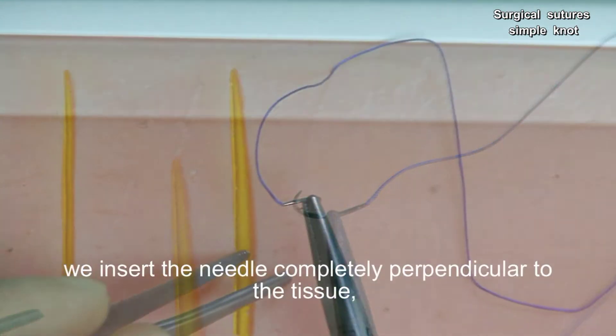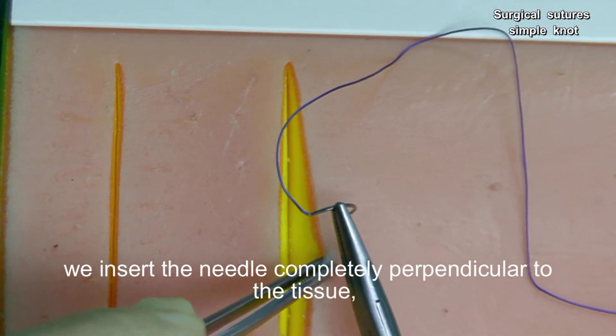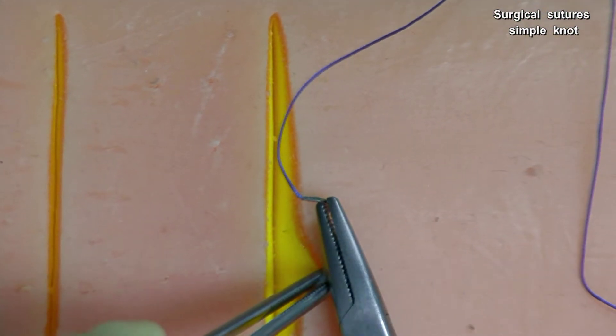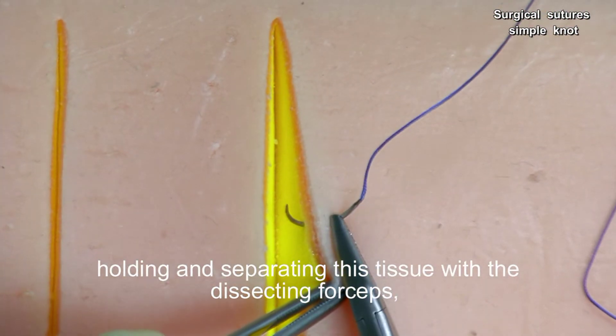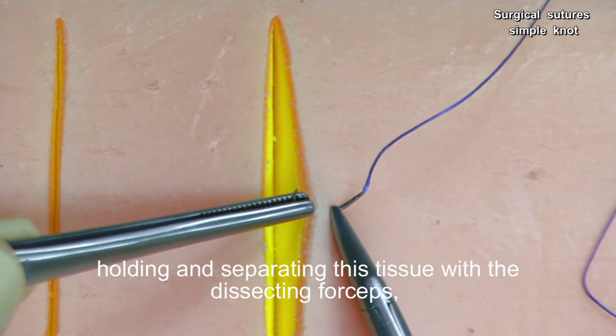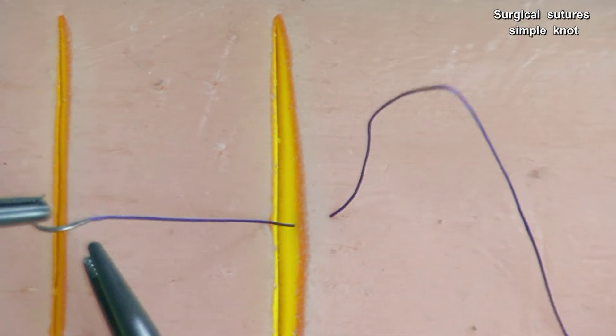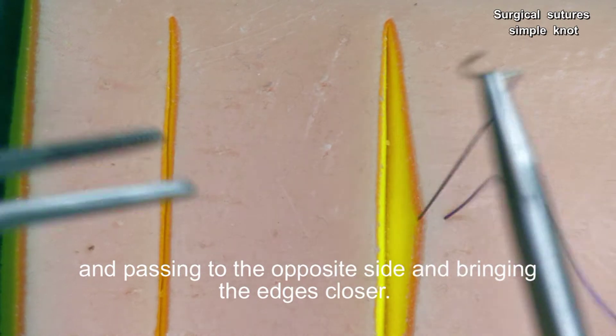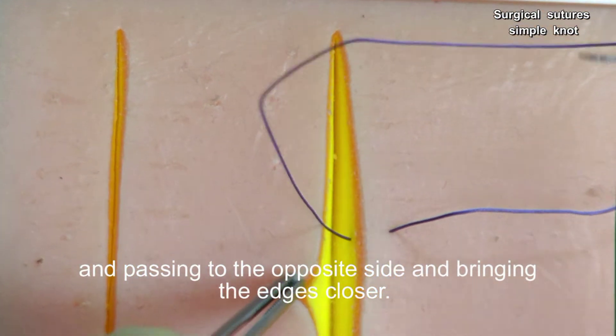To make this stitch, we insert the needle completely perpendicular to the tissue, holding and separating this tissue with dissection forceps and passing to the opposite side and bringing the edges closer.